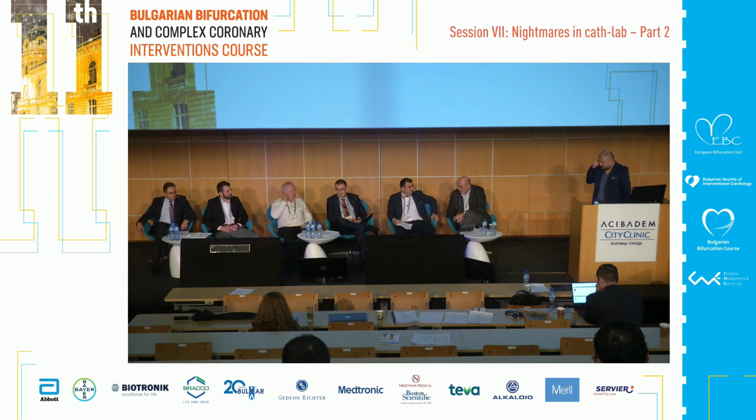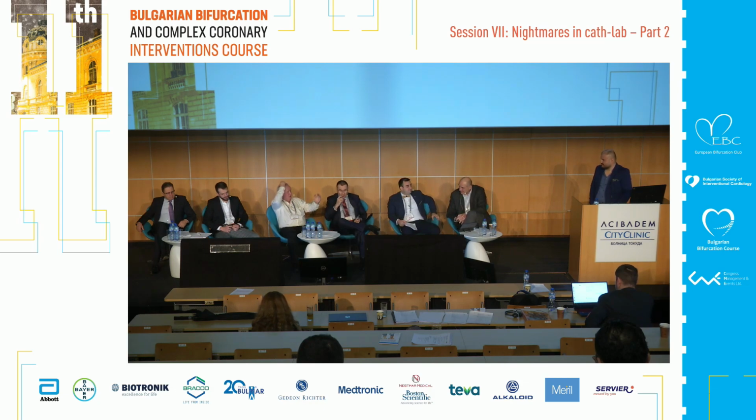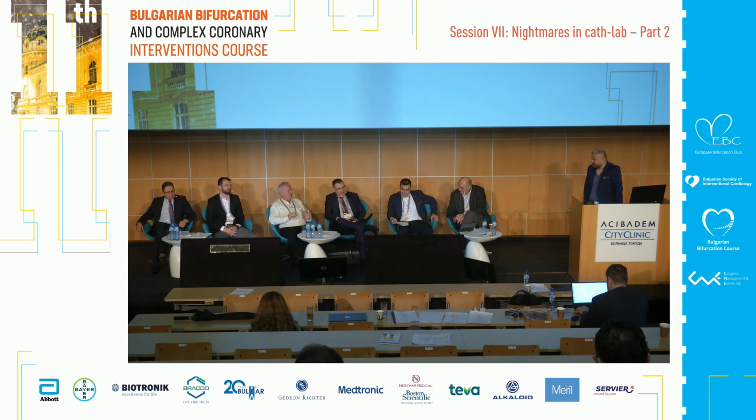I guess a lot of comments will follow. My comment will be, we discussed that already yesterday. Instead of ostial stenting of the LAD, personally, I do a crossover. If you do a crossover, you open properly, you re-enter the side branch through the most distal cell, and you do a good kiss. After that, you are protected for any kind of problem like this.